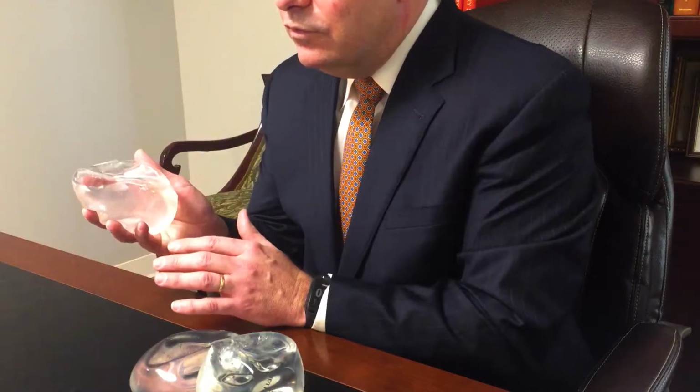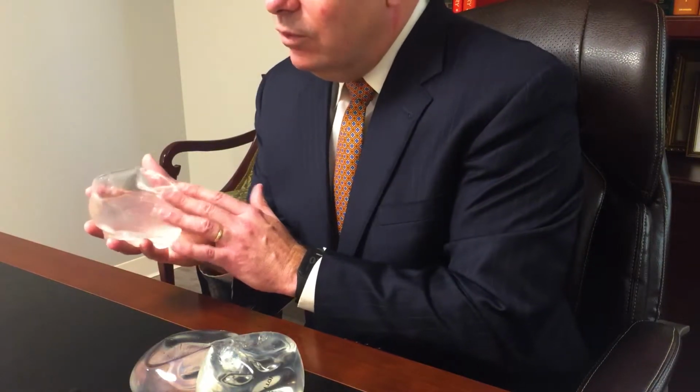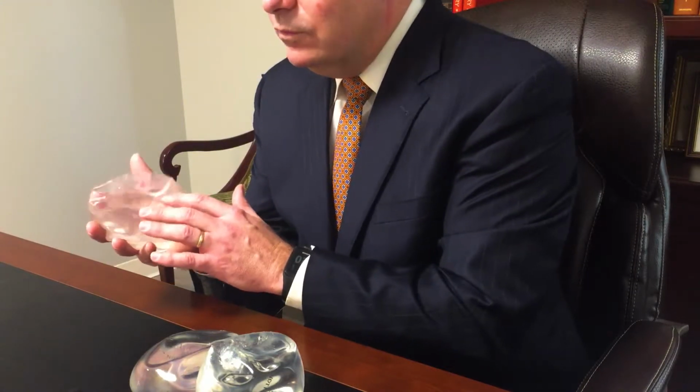However, there are disadvantages to saline implants also. First of all, because they're filled with saline, they tend to slosh around a little bit. They don't hold their shape quite as well, and you can get some rippling deformities, and they don't feel quite as natural as silicone implants.